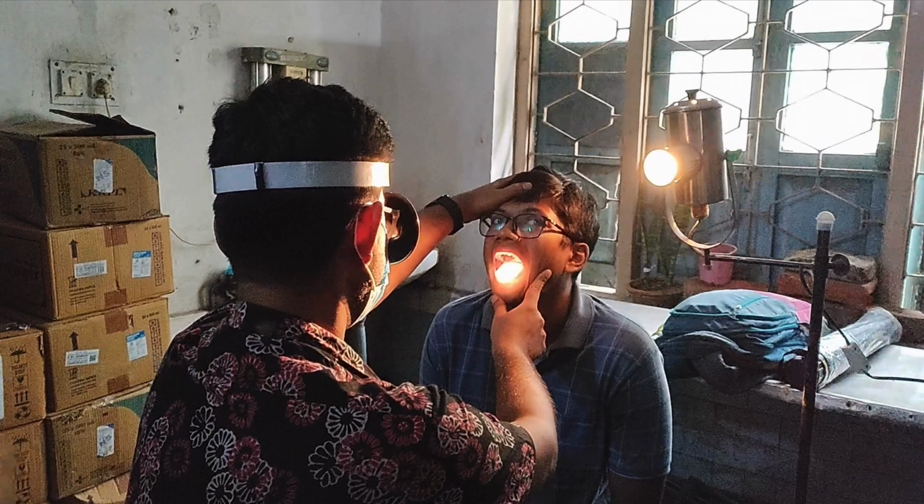Coming to the setup that you need to have, behind the patient is the bull's eye lamp, which is placed behind the patient and on his left, just above the left shoulder. The light from the bull's lamp is coming onto the head mirror which I am wearing, so that light from the head mirror is now getting reflected onto the part of the patient that I want to examine.